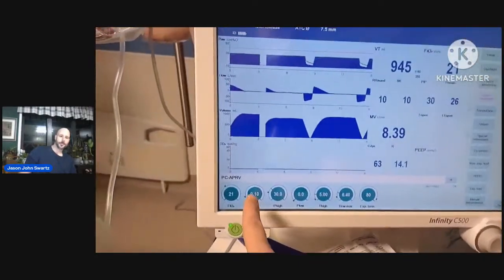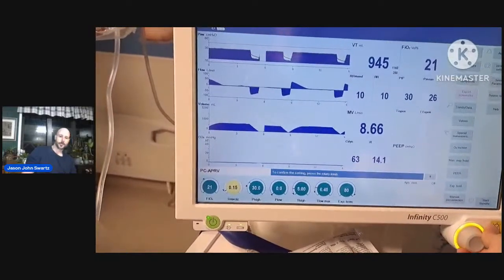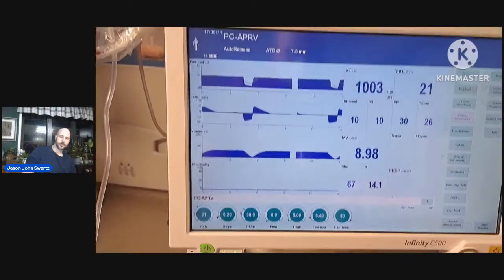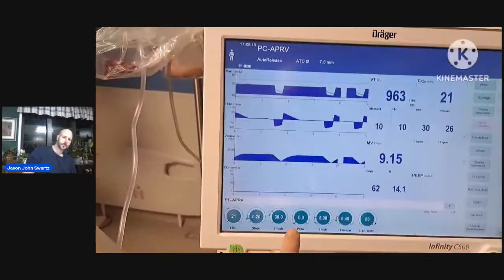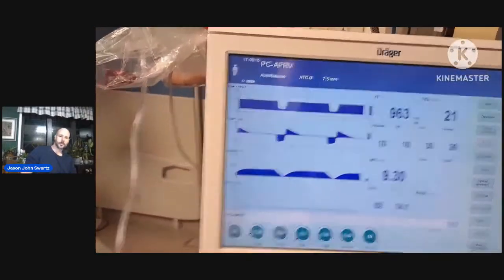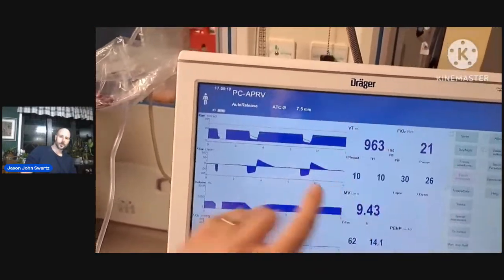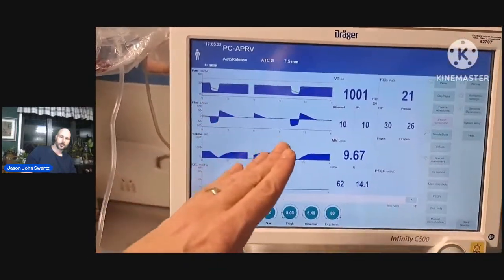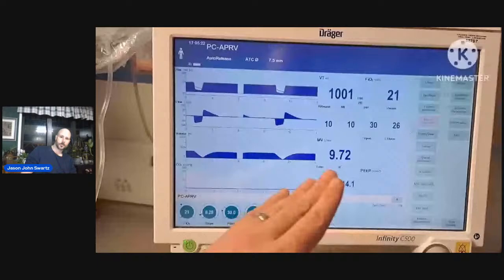What you can do, you will adjust a little bit the tidal volumes with your slope. Because there's a slope here, and the descent is a little slower to go up, the viscoelastic property of the lung allows it to go down a little more, just a fraction of a second, and it can play with your tidal volumes.